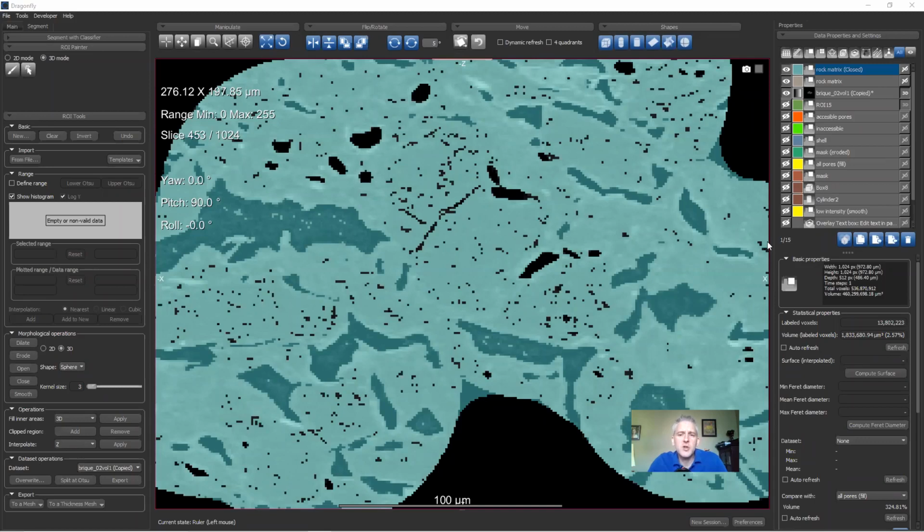So you say your computer continually crashes and you have small micro CT data sets that are less than 10 gigabytes. Well, you need a more powerful computer. A lot of people's computers are used for composing emails and editing manuscripts and using web apps. And those don't use demanding resources. So your laptop may be 100% perfect for all of those. But if you need to process data, then you obviously have to have enough memory. If your data set is 10 gigabytes, then I suggest you have 30 to 60 gigabytes of memory so that you have room in memory to make derivatives of your data and process.